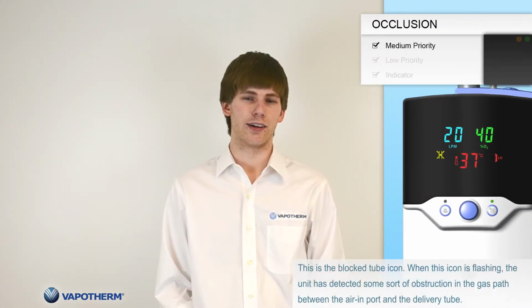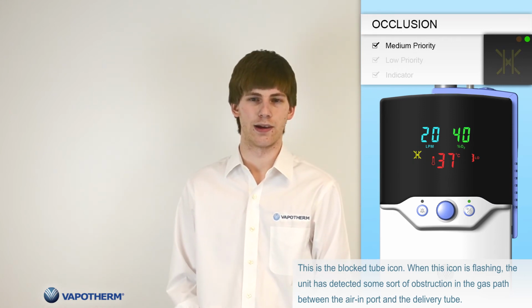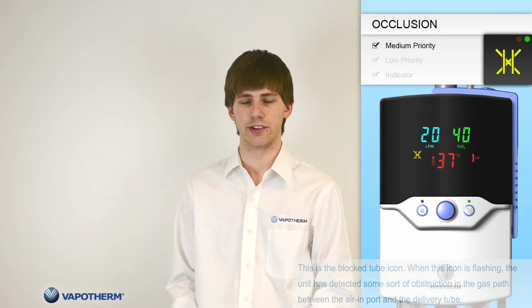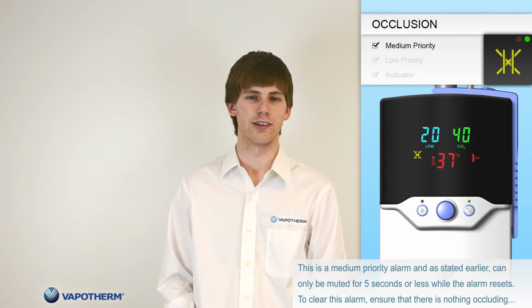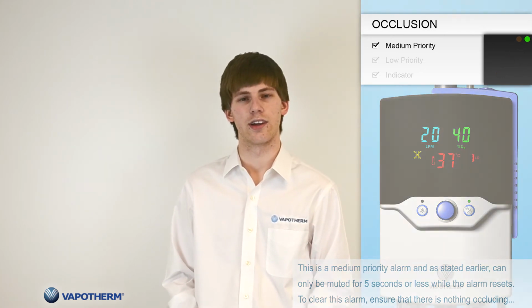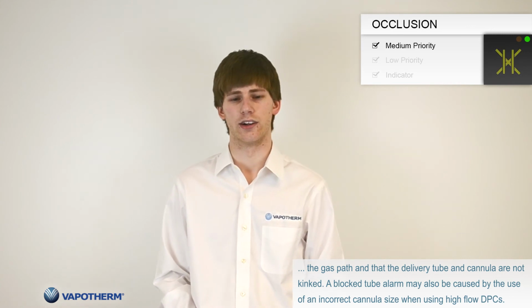This is the block tube icon. When this icon is flashing, the unit has detected some sort of obstruction within the gas path between the air input and the delivery tube. This is a medium priority alarm, and as stated before, may only be muted for 5 seconds or less as the alarm resets. To clear this alarm, ensure that there is nothing occluding the gas path and that both the delivery tube and the cannula are not kinked.